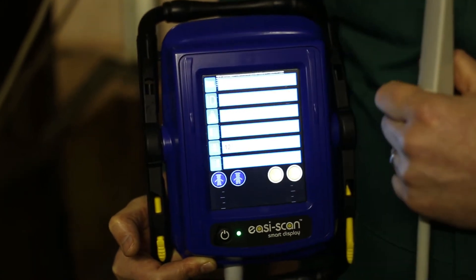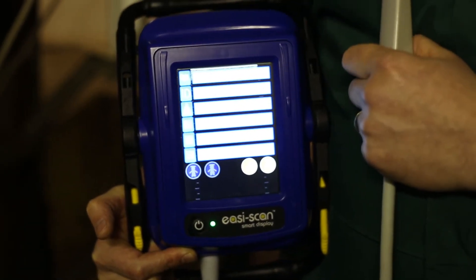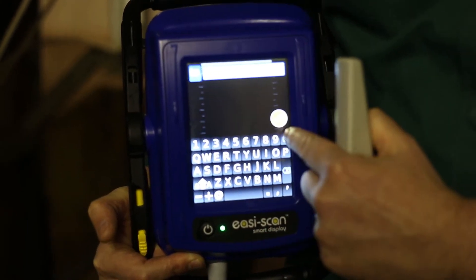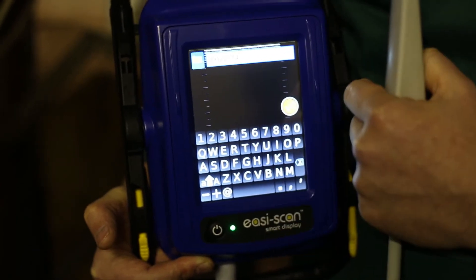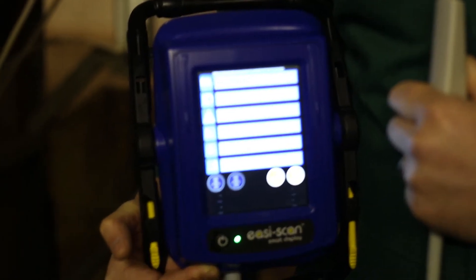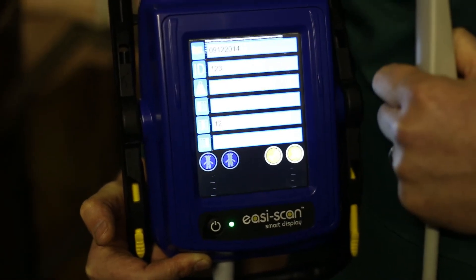This then comes up with the opportunity to save the patient details. At this stage we want to put in the folder, which could be the date. We put in the date and press the save button. The ID is the patient or animal ID, and then press the save button.